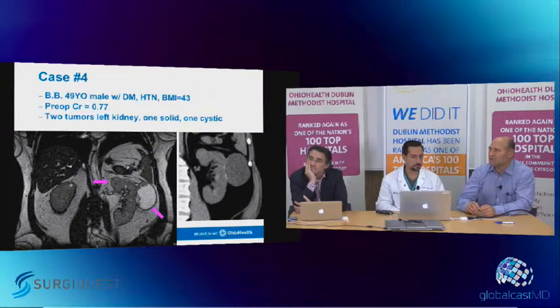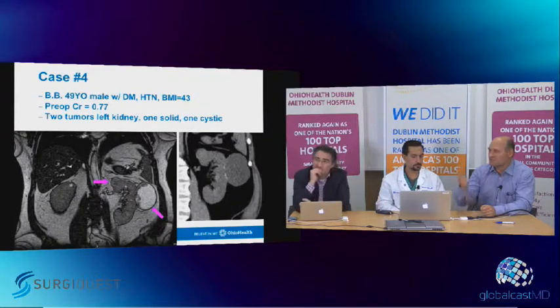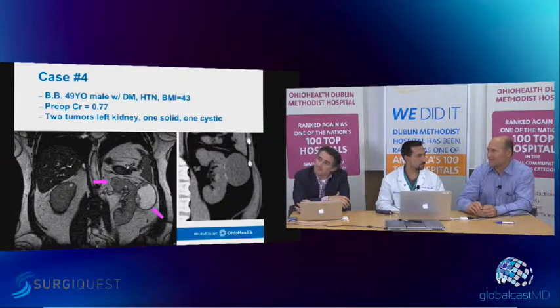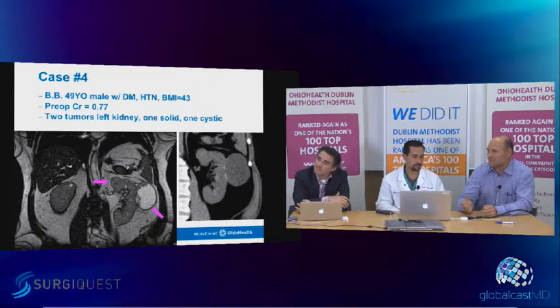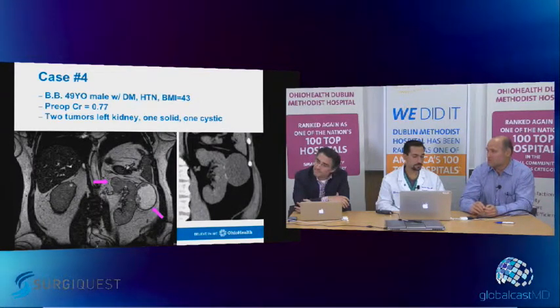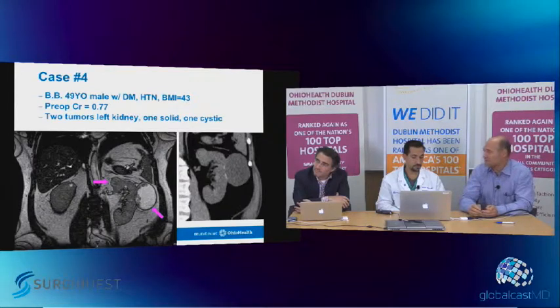Yeah. So I think you could probably. So this stuff enhances at the base, or is it just debris? Do they know? Didn't look like it was enhancing. Yeah. So it's really hard to know if this cyst is an issue or not. If the wall's not enhancing and it looks like there's no, I don't see any septations in there. I mean, this could just be a cyst that he bled into, and it might just be that.